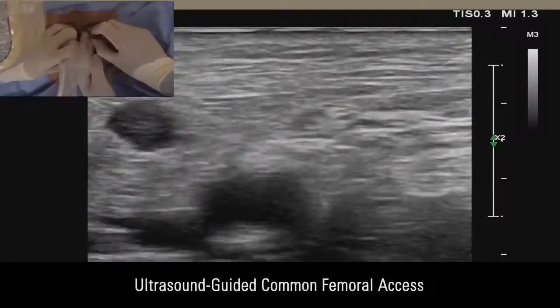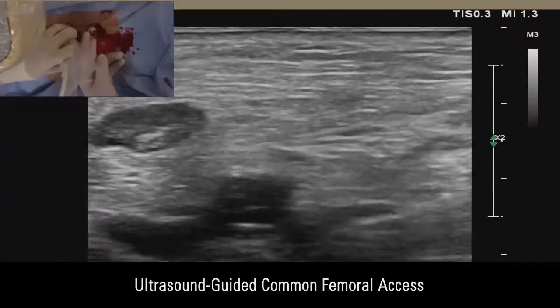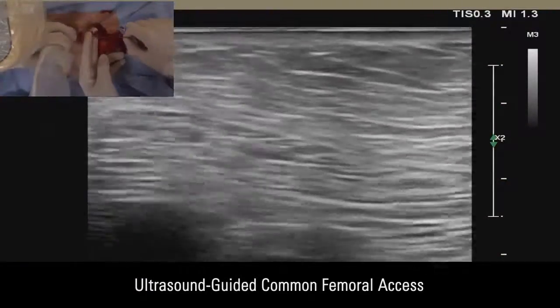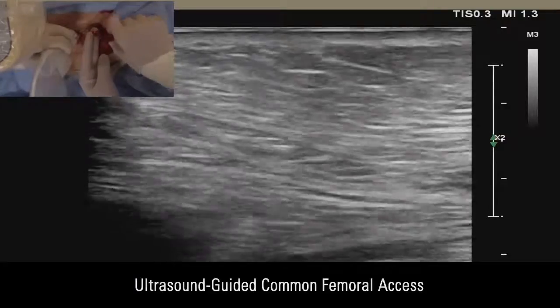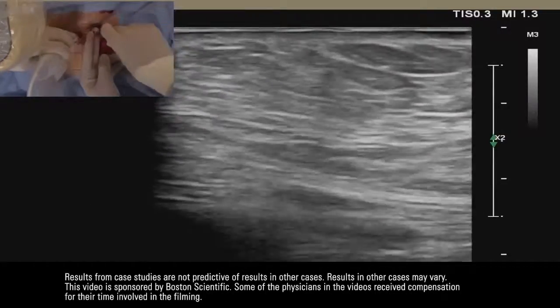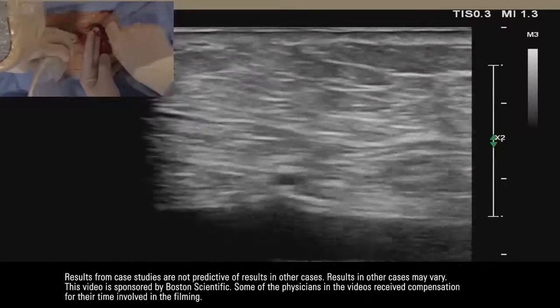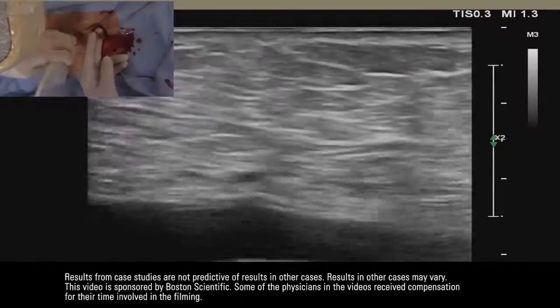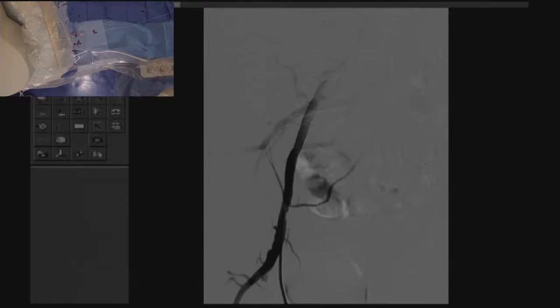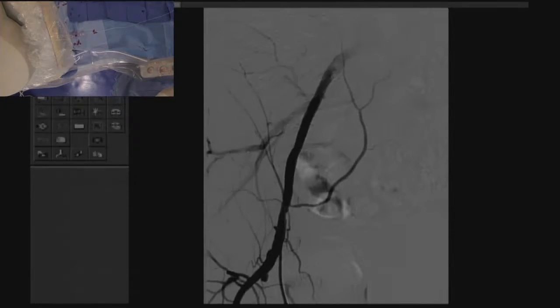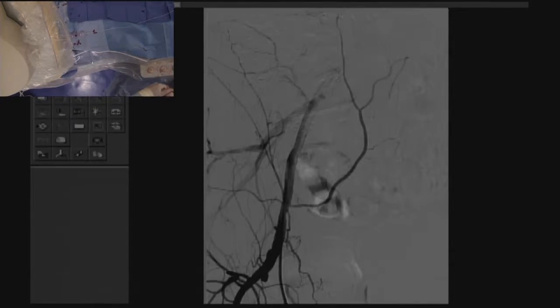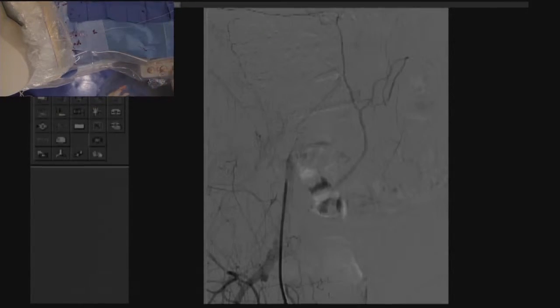We usually start with retrograde common femoral artery ultrasound-guided access, as demonstrated here in this image, advancing the wire under ultrasound guidance. An angiogram of the sheath confirmed our position within the mid-common femoral artery.